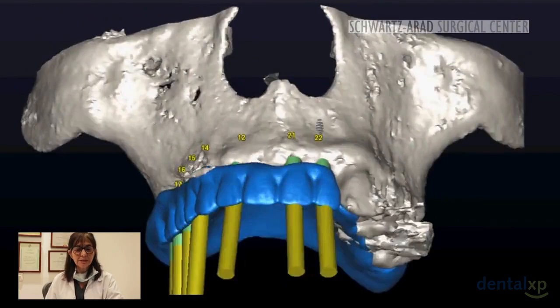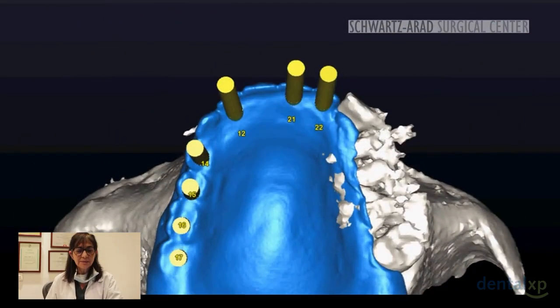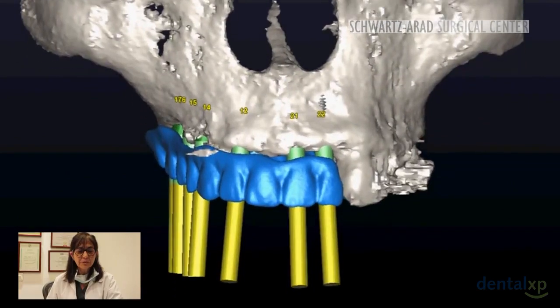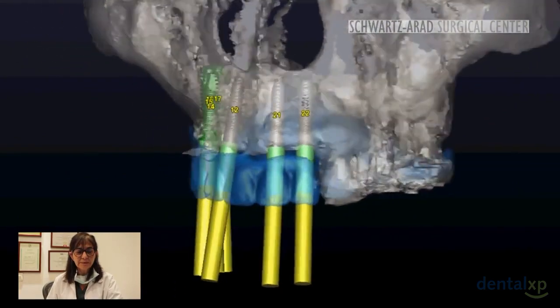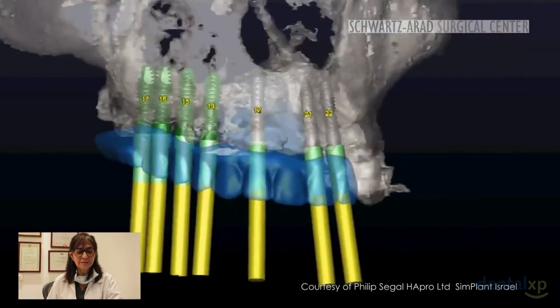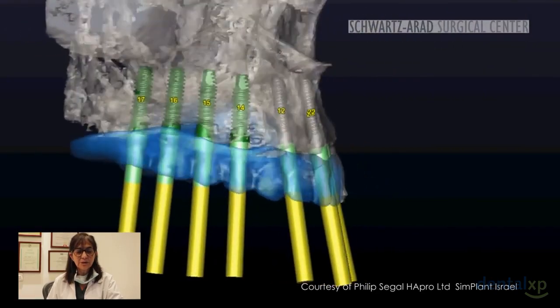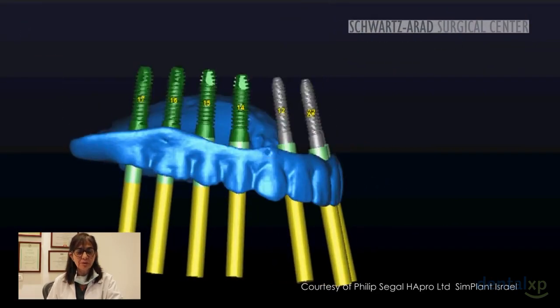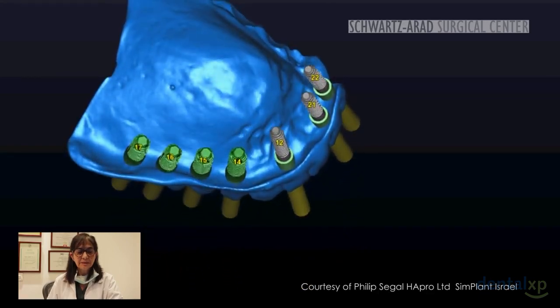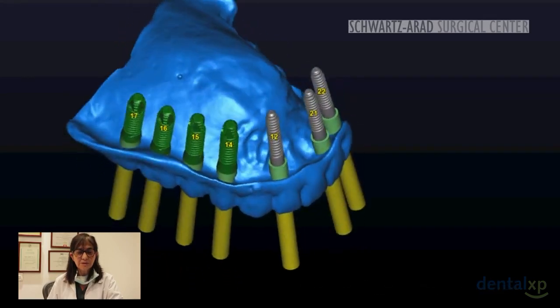And here you can see the desired position of the future implantation. All the implants are placed in the premaxillary and right area, together with the sinus procedure and augmentation, horizontal augmentation via block graft and implant placement, and then the temporization as well.